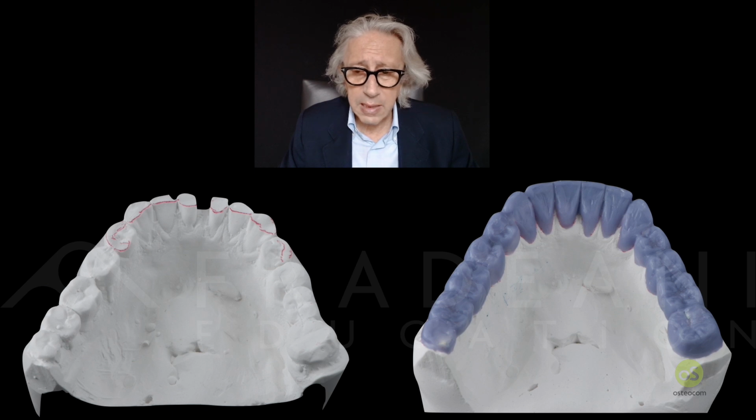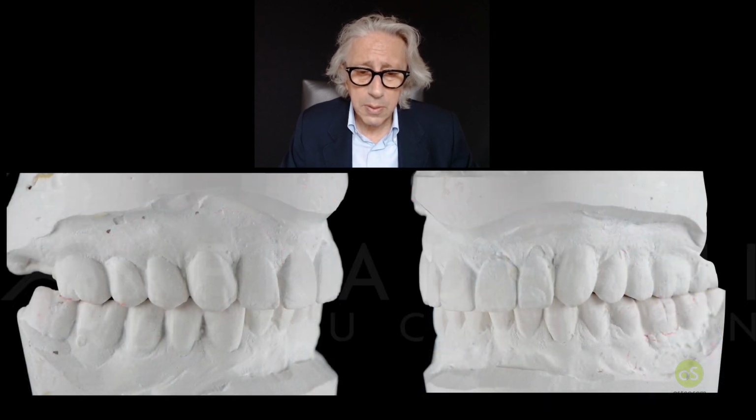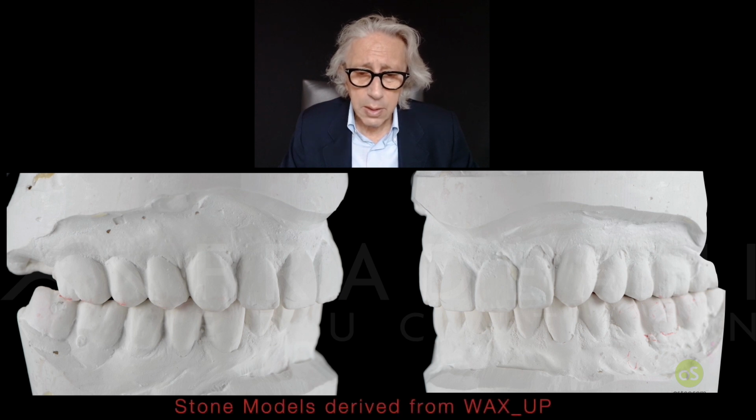And I could say that Giancarlo Barducci, my technician, we've been working together for the last 40 years, unbelievable. He is really great at changing the shape and creating better contour for restorations. So the final wax-up was made. And now we have the stone model derived from the wax-up.